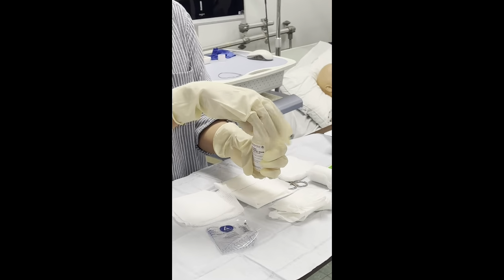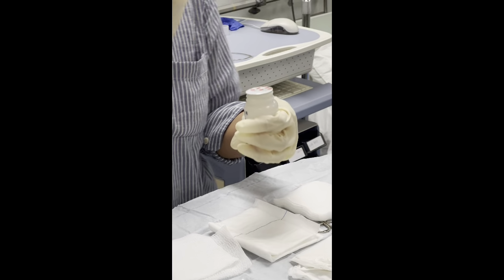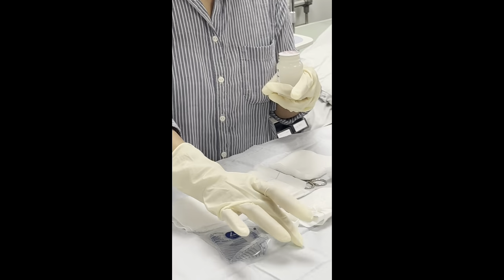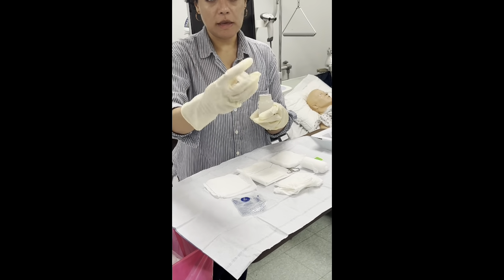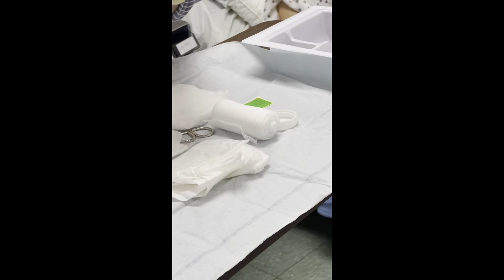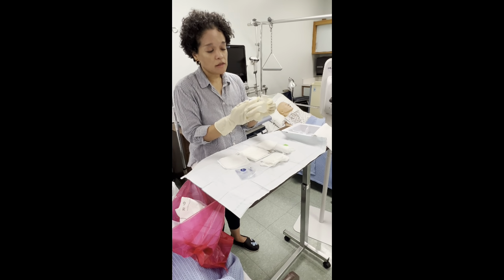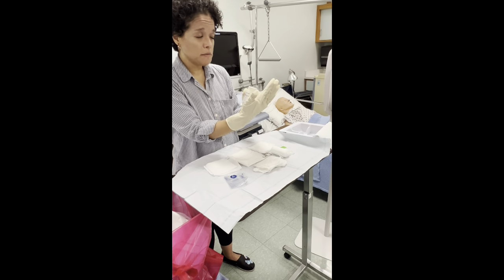So I'm going to remove the cap. Be mindful of how you place the cap. You want to make sure that the inside of the cap is facing up, facing to the ceiling. It's not facing downward, as that would be considered contaminated. So placing that here. As you pour the solution into the container here, you want to make sure that the label is facing inward inside of your palm here.